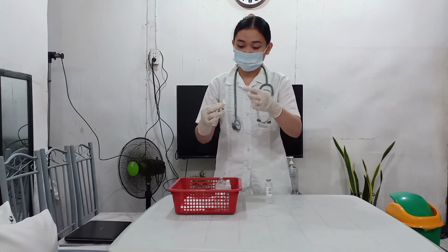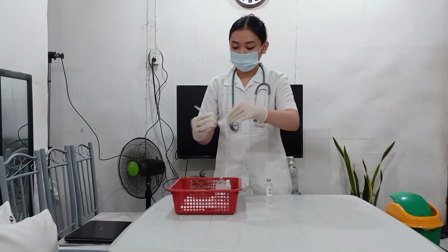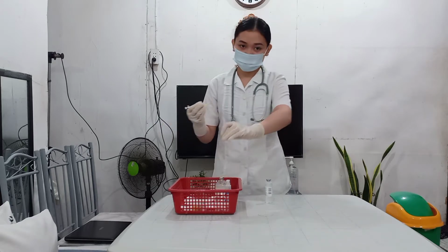Make sure to keep the cap also because we are going to use this on the disposal later.